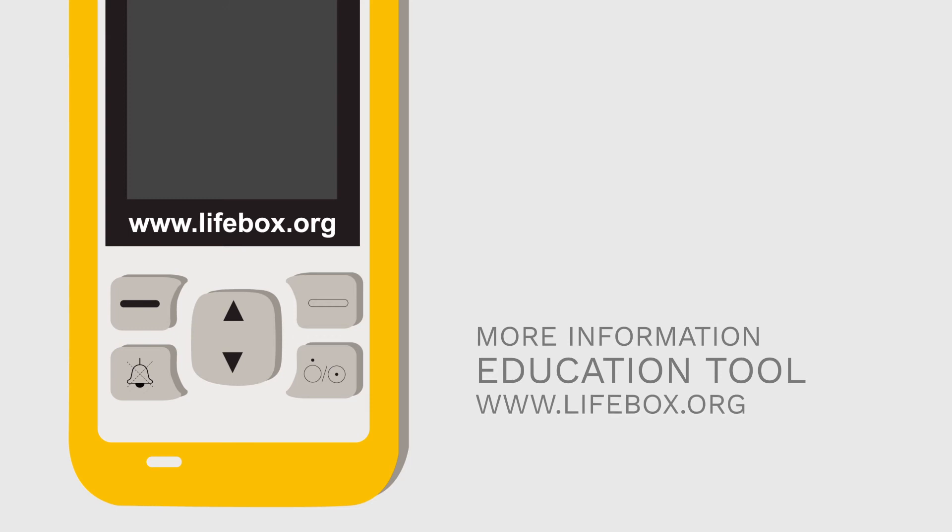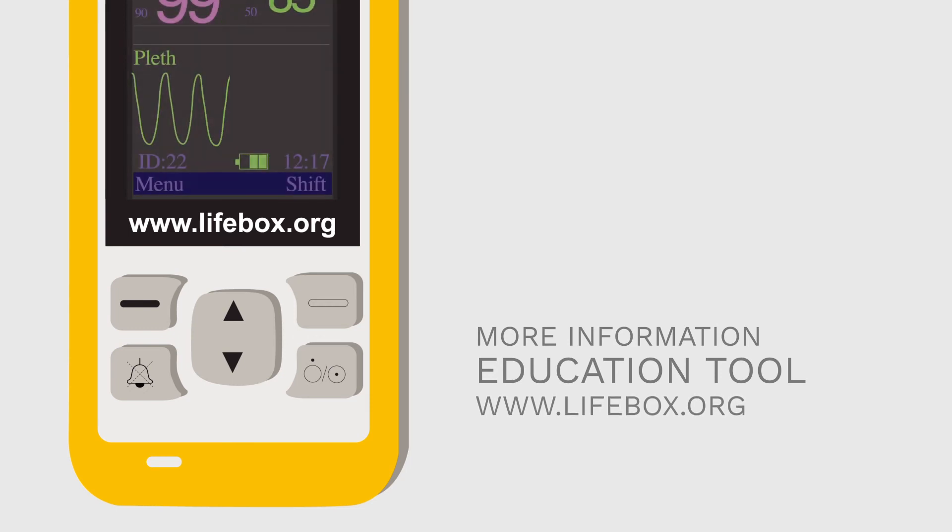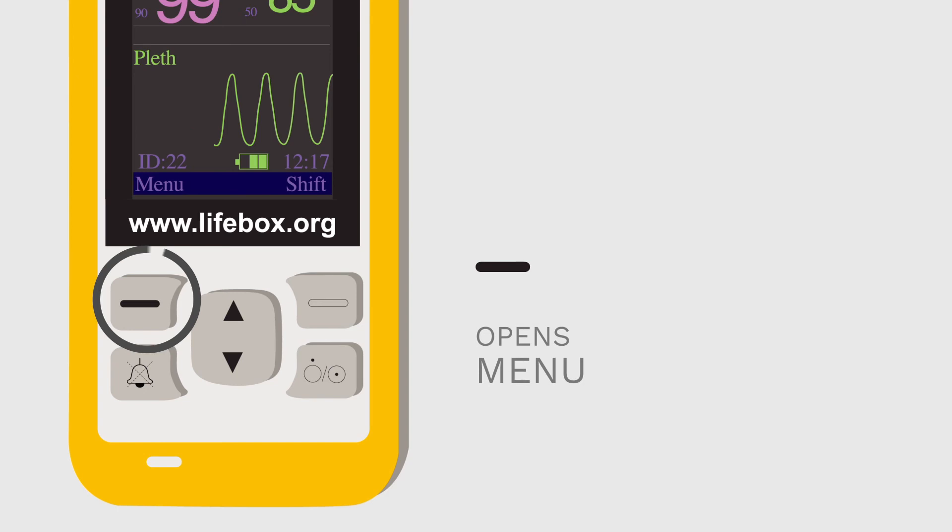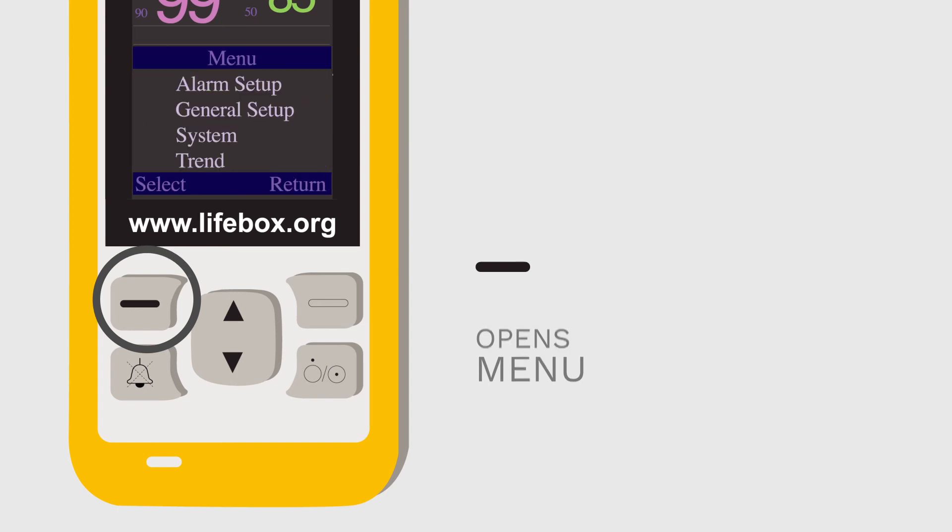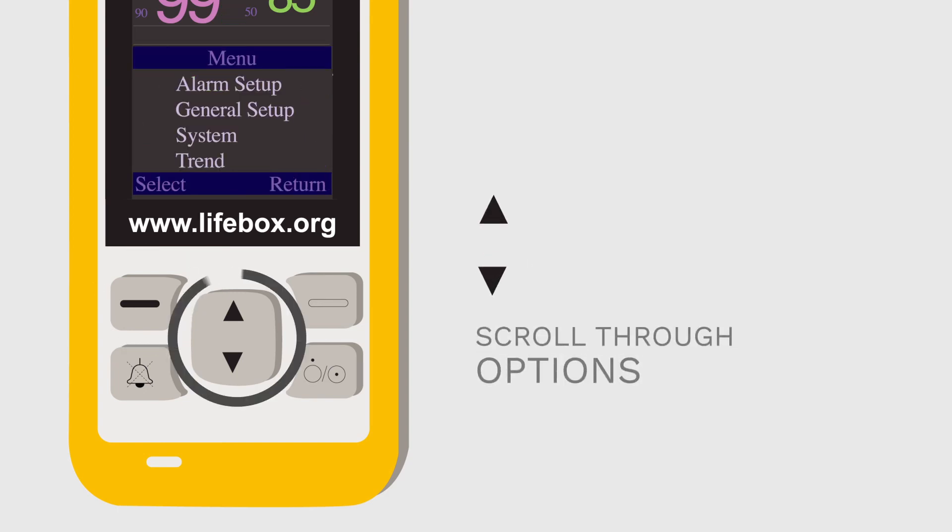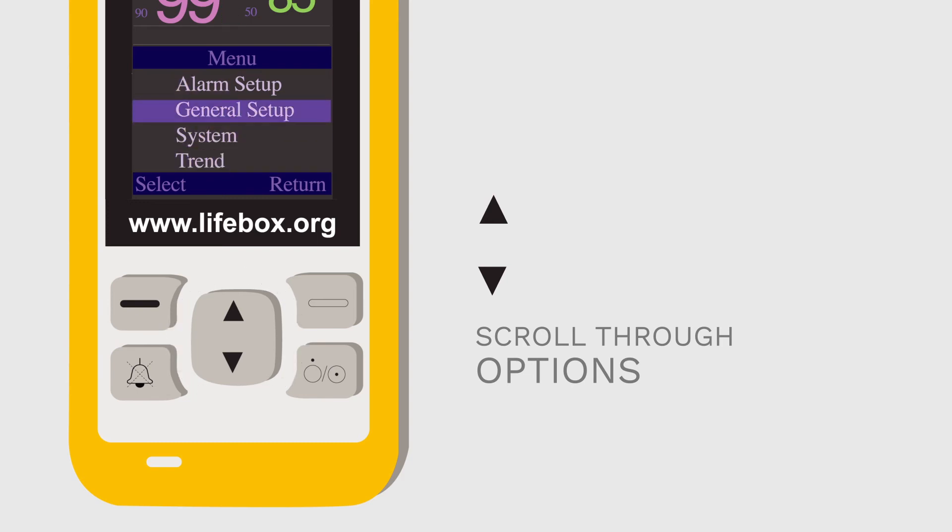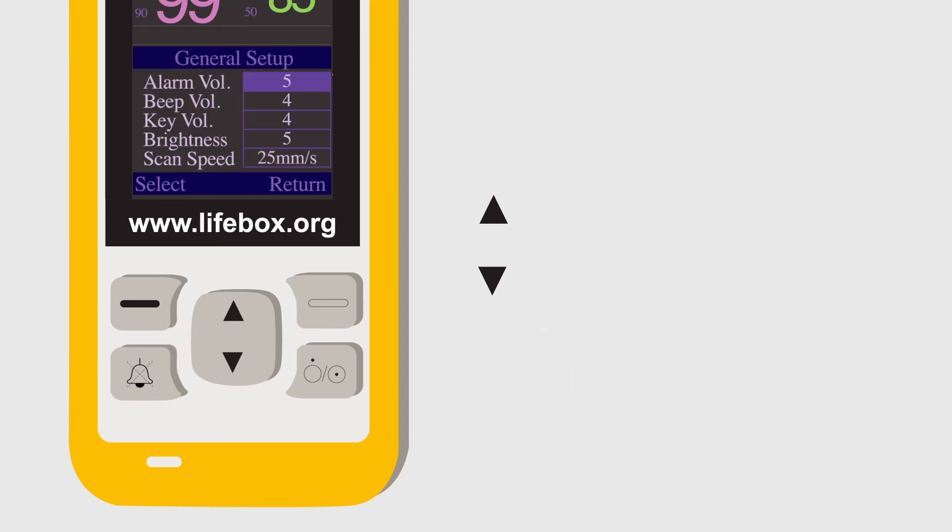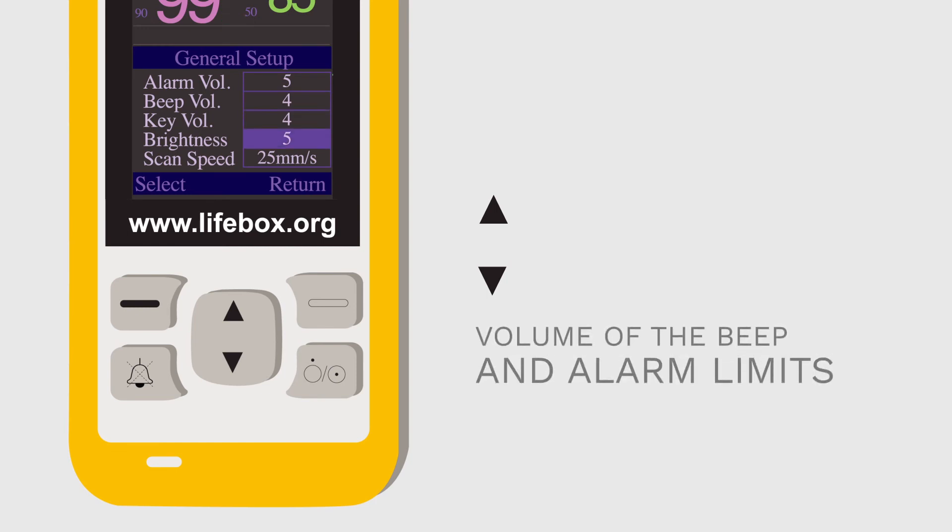On the opposite side, this button opens the menu. The button in the middle, the up-down, allows you to scroll through options in the menu. The menu allows you to change certain features, such as the volume of the beep and the alarm limits. For more information, consult the user guide.